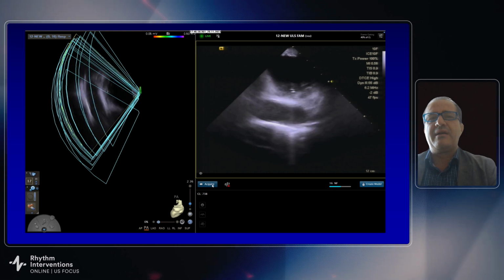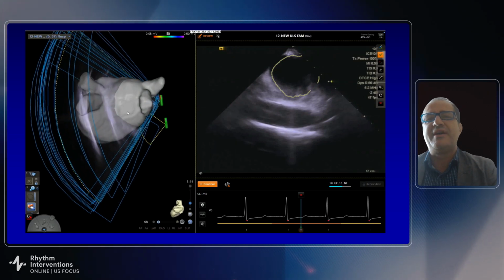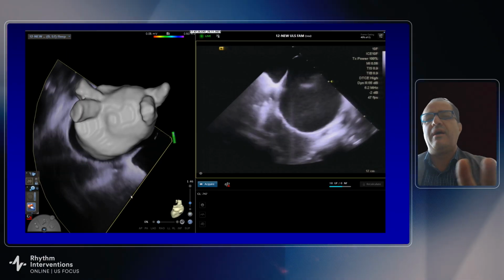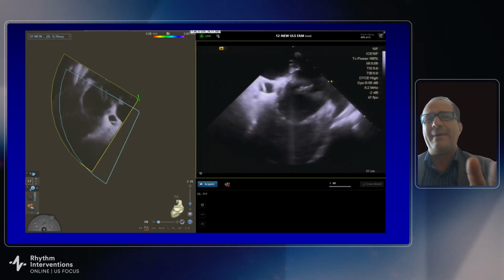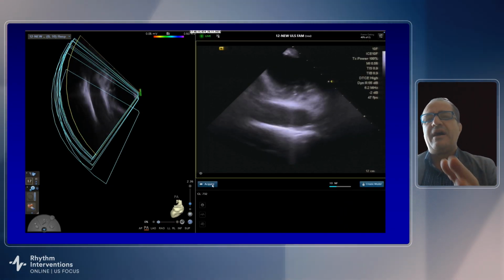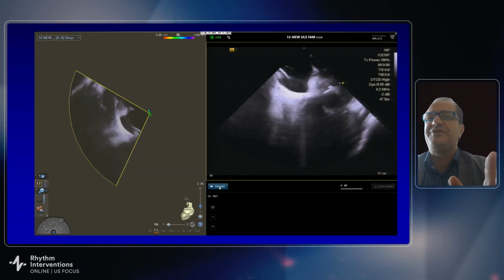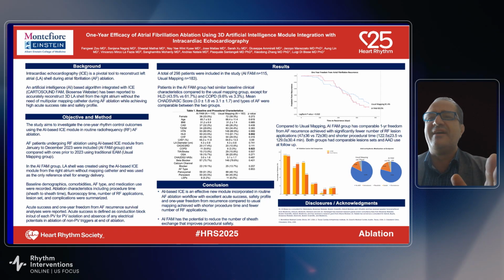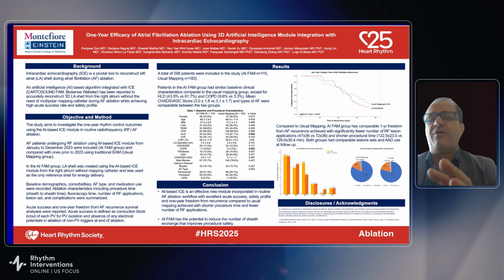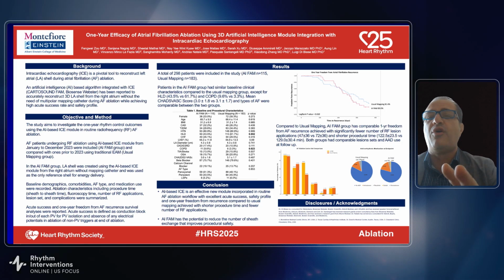And I love it because while I'm understanding the anatomy of the patient, you have a shell of the left atrium. I was already using this workflow with the RF, but now with PF it becomes extremely good, because with ICE I go transseptal, and based on that shell, I can basically start the ablation as long as I have given a full amount of heparin. And this is a paper that is almost in press in Europace. It's under second review, where we did this workflow with QDOT.